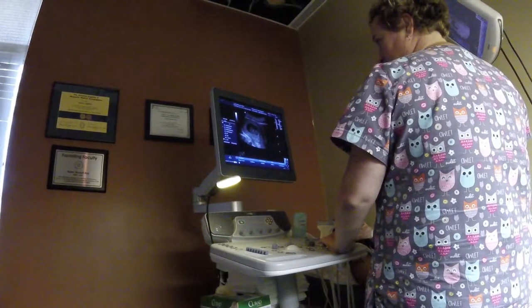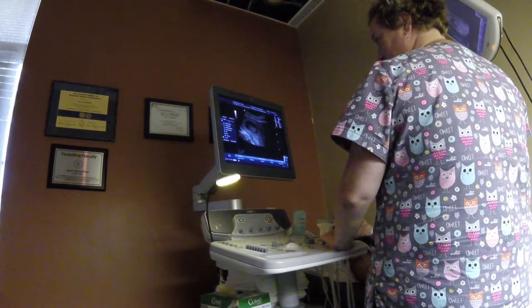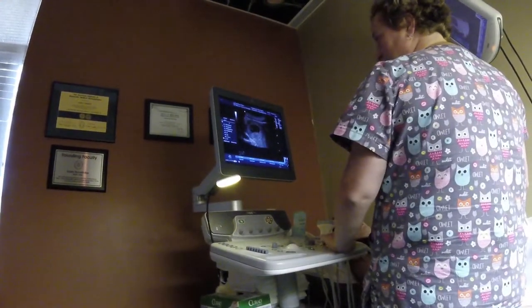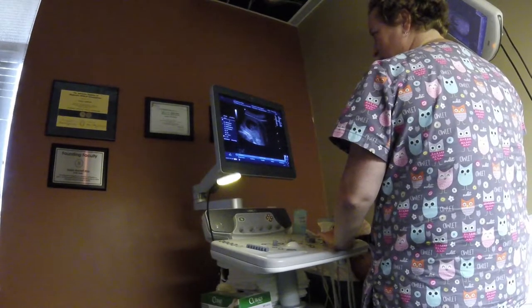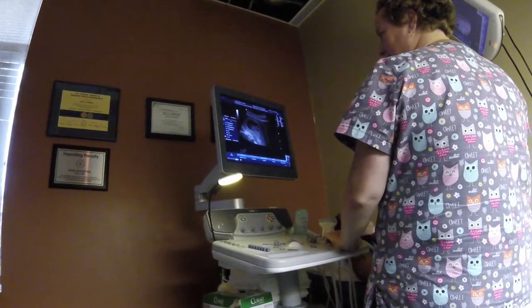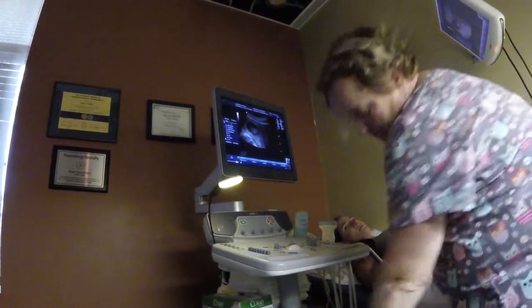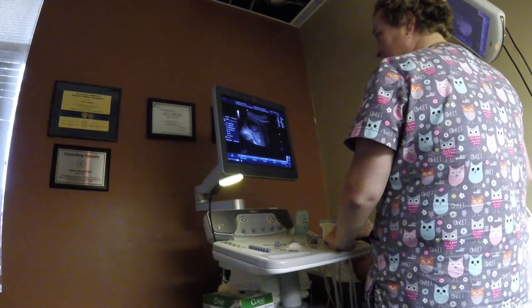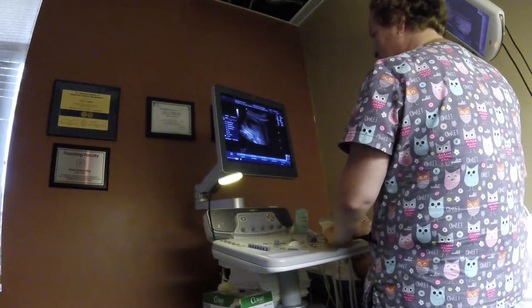So now it sort of flipped around. Notice it's the other way. Is that his arm there? Yeah, just a little, they call them buds at this point. Now the head's here, before it was there. Oh, really? Yeah, he flipped. Baby's doing its aerobics in there, so you're good.